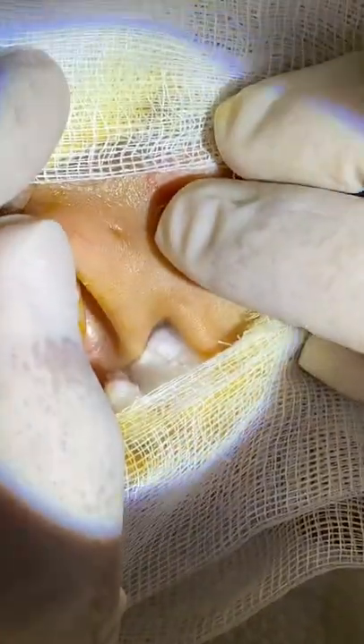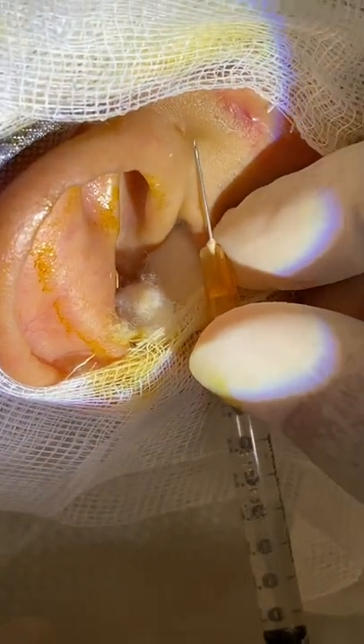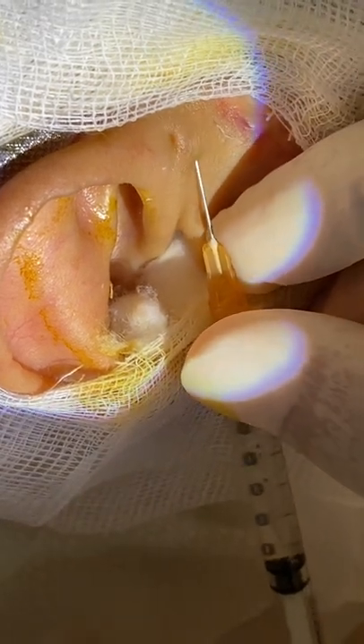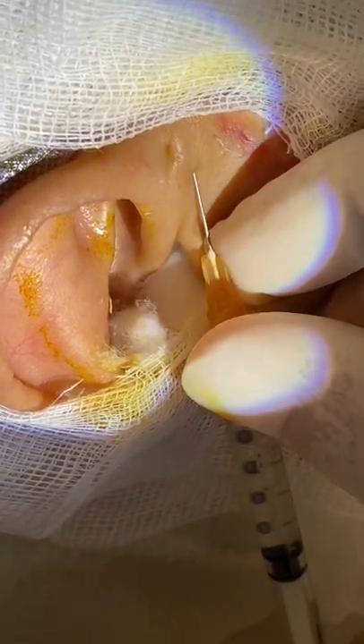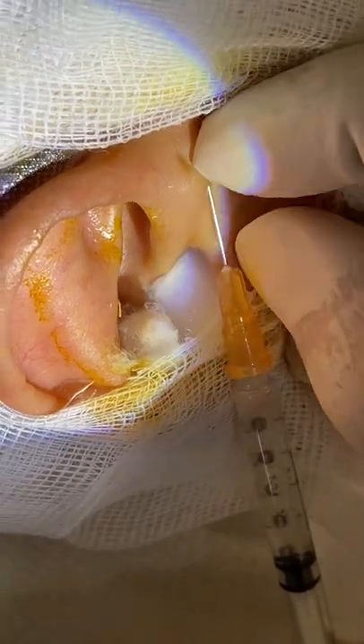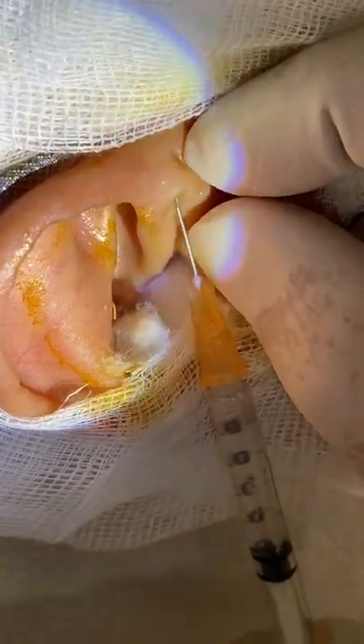We are going to perform this by local anesthesia. I'm now injecting local anesthesia so that the patient won't feel anything during the surgery. This is a minor surgical procedure.